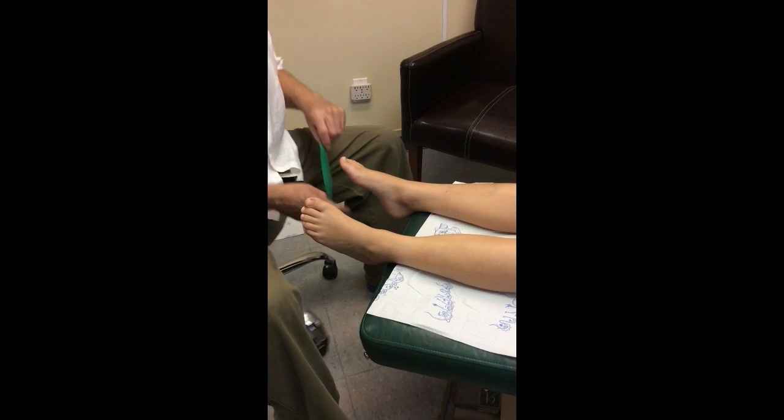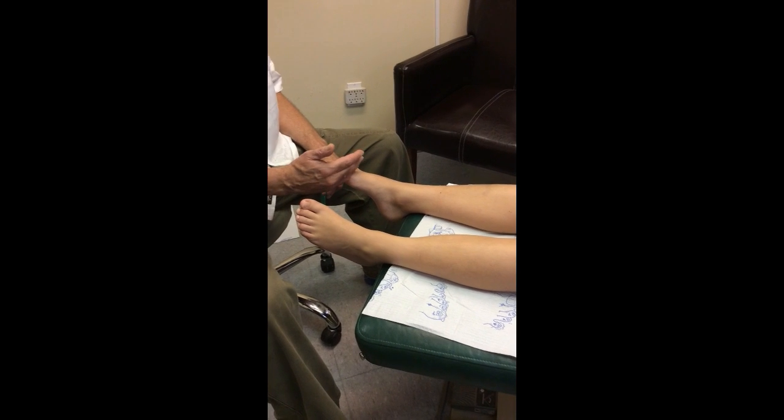He tested poorly in stance. What we're going to do is measure his foot — his rear foot is stable and his forefoot is flexible.